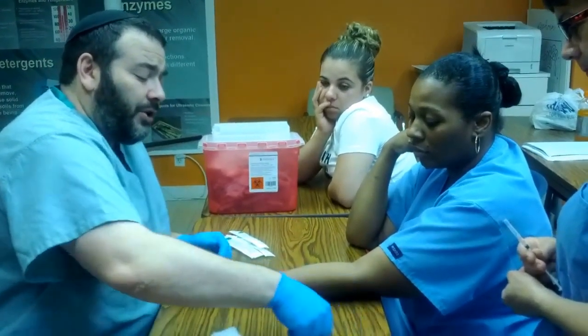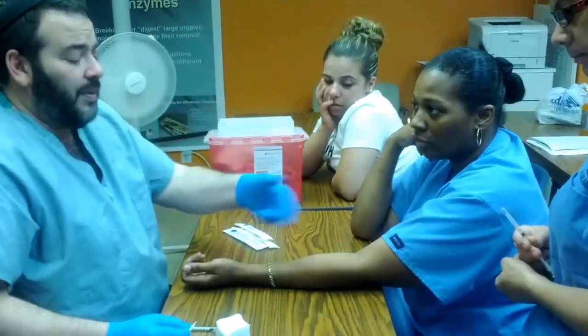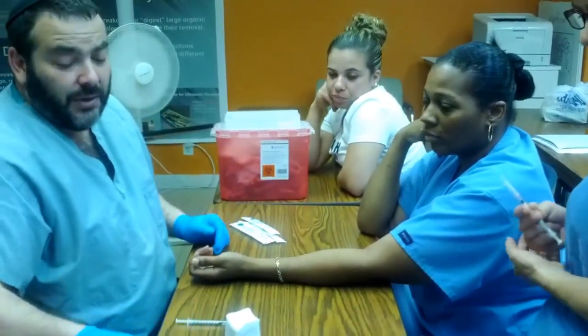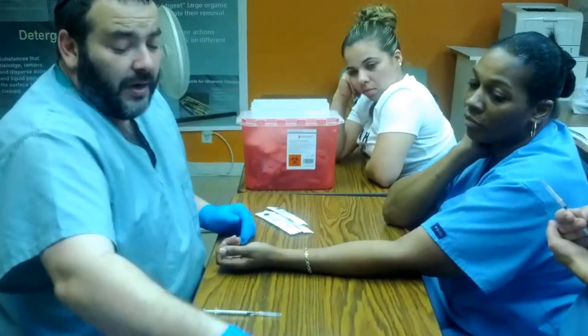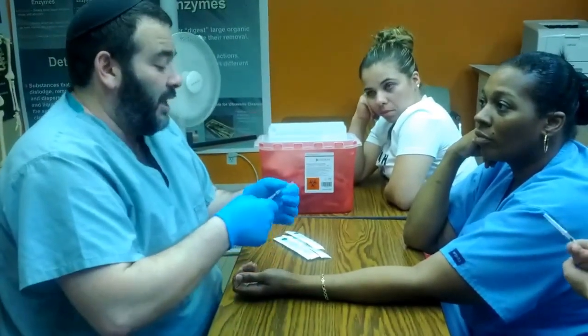We never do it in a circle, always in a spiral, going in increasing circles from the middle out, pushing the dirt out to the outskirts. For any injection, as for anything else, make sure the alcohol dries. It's because the alcohol causes pain, not the actual needle.